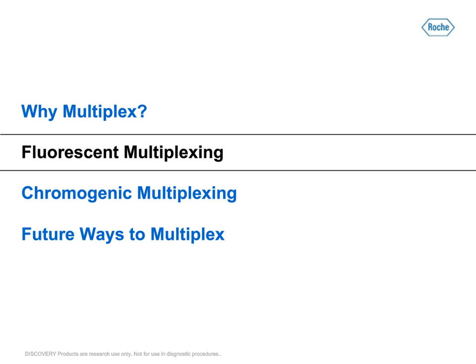So for this example here, in this cartoon schematic at the bottom of the slide, you have 4 different targets of interest. But in order to achieve this, you would have to have 4 different primary antibodies generated in 4 different species, and then you would come in with whatever these may be, maybe an anti-rat, an anti-rabbit, maybe an anti-goat, and an anti-mouse.